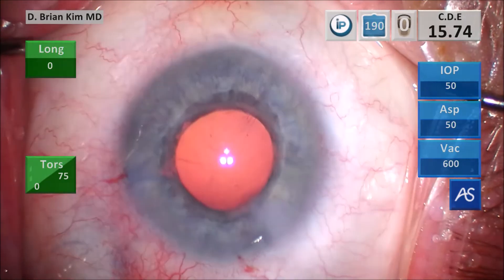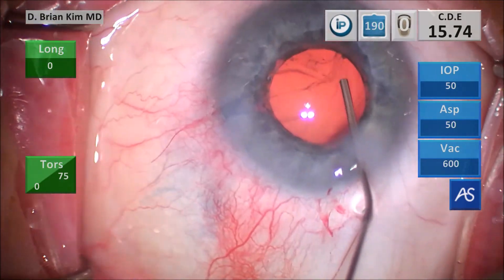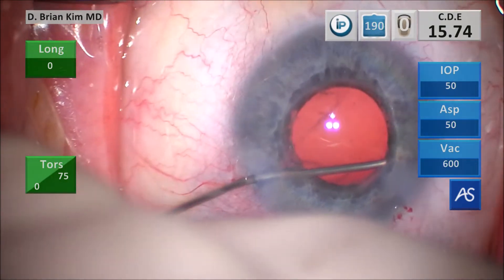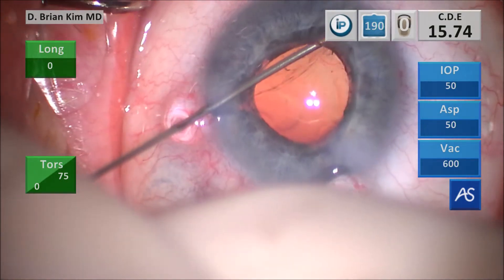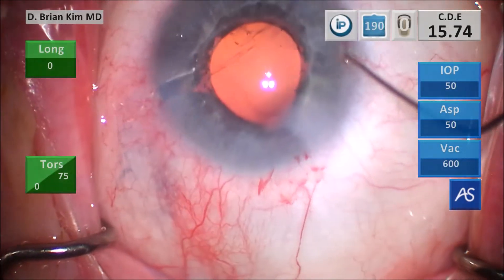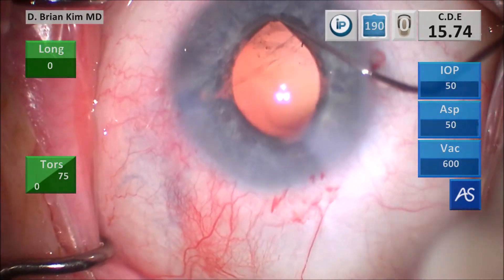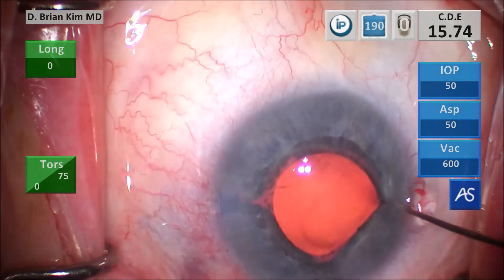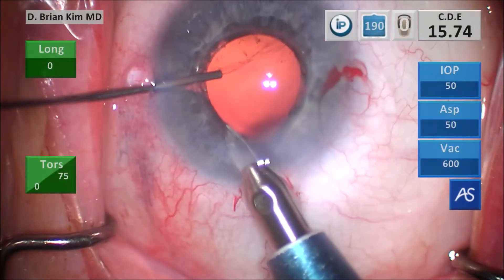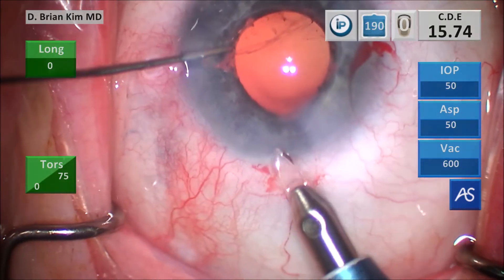I come out with the phaco tip. At this point I'm inspecting my anterior capsule, putting more dispersive viscoelastic to lift the iris and making sure I can see that the anterior capsule is intact. Then I go back with the Maltsman, retracting the iris, and I'm able to see confidently that the anterior capsule is intact 360 degrees. This is important because now I know how I'm going to place the lens. I'm widening the incision for my three-piece lens and will place the lens into the sulcus.